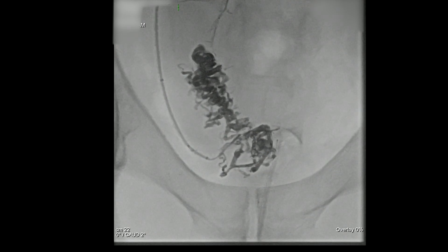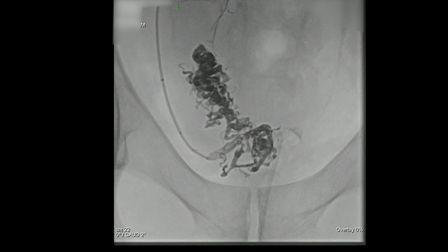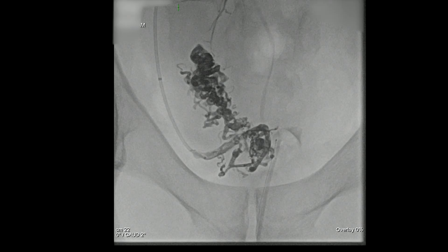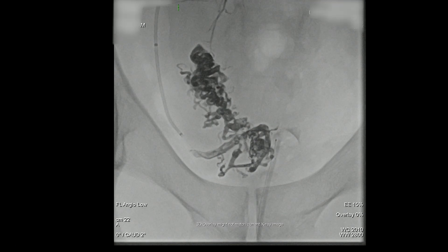I find onyx to be very safe and very predictable. Once we've taken the majority of this out, you can start seeing the onyx backing up into the big feeding vessel. Although you should never take out something like the entire internal iliac, I've seen people put covered stents across the origin — that doesn't do anything. Here we're just going to back up the onyx with a couple of coils that we drop into that main vessel.